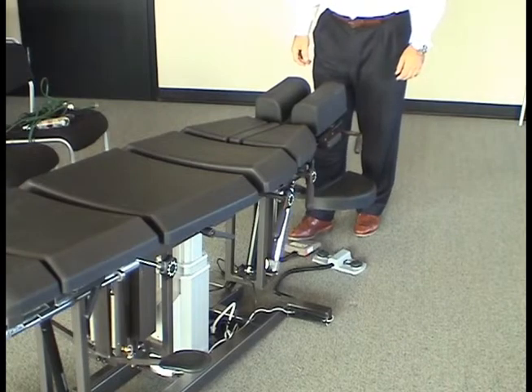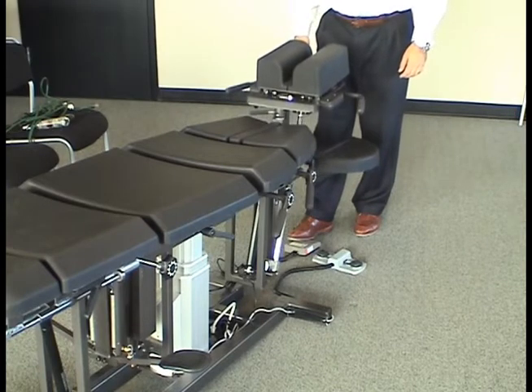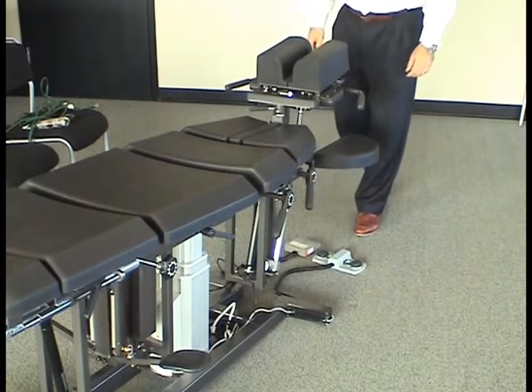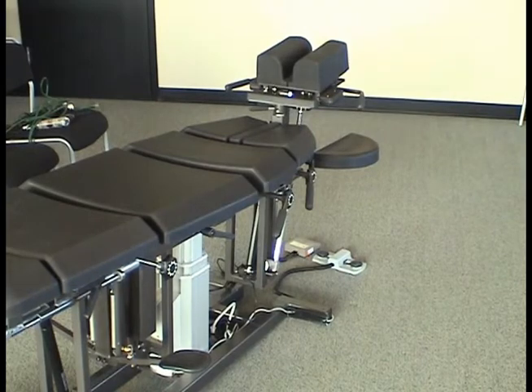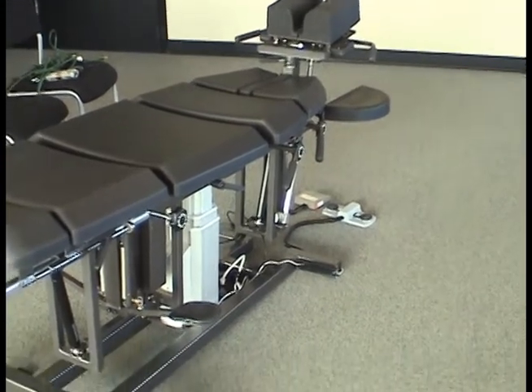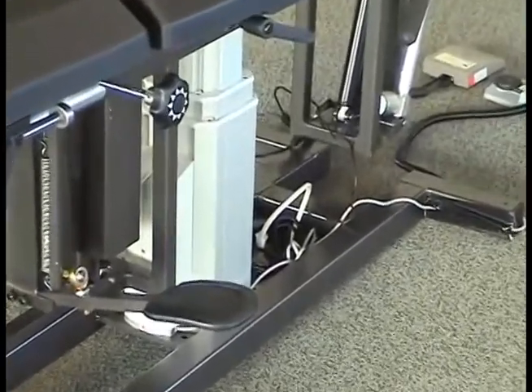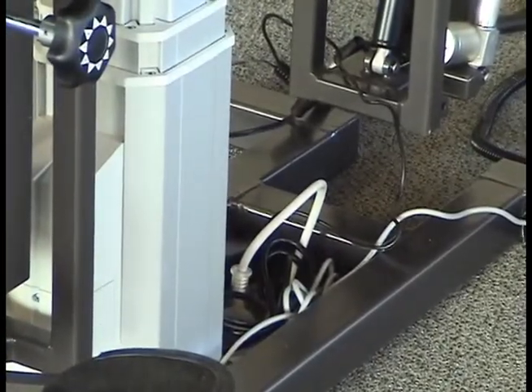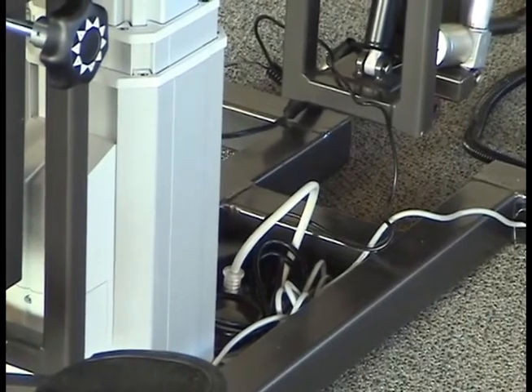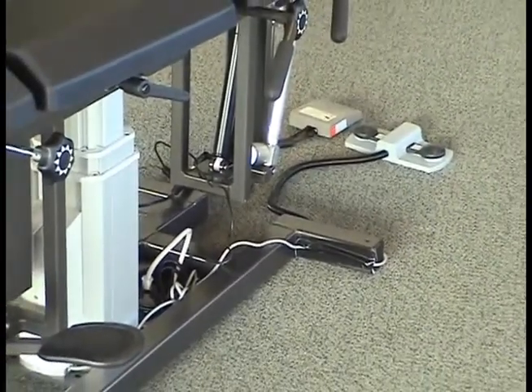If you ordered the electric elevation motor on your table, the foot switch can be placed just next to the headpiece foot switch. Once again, taping the cord to the floor is recommended so no one trips. An electric power strip can be placed on the floor inside the frame just in front of the electric elevation motor. Both motors could be plugged into the power strip, and the power strip would then be plugged into a wall outlet. The primary advantage of a power strip is that only one cord would run from the table to a wall outlet. If you have the ability to use a floor outlet, this would eliminate any power cord running to a wall outlet.